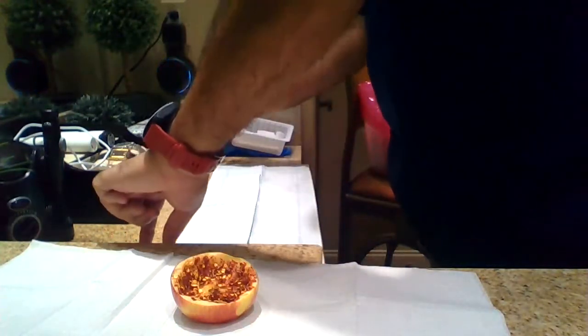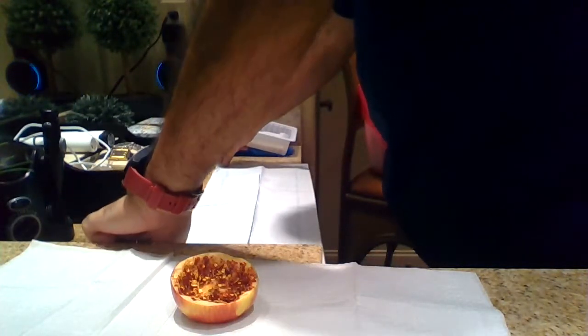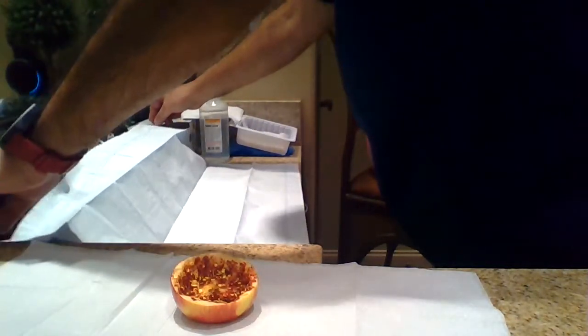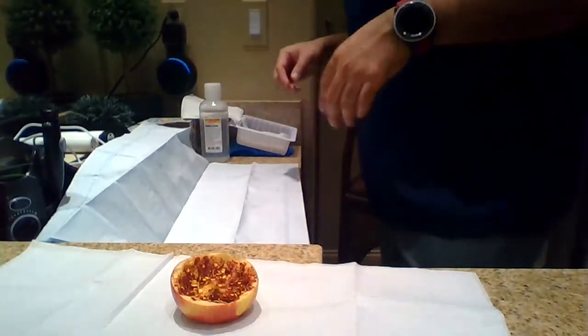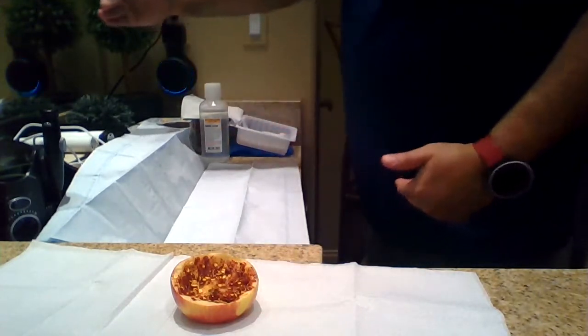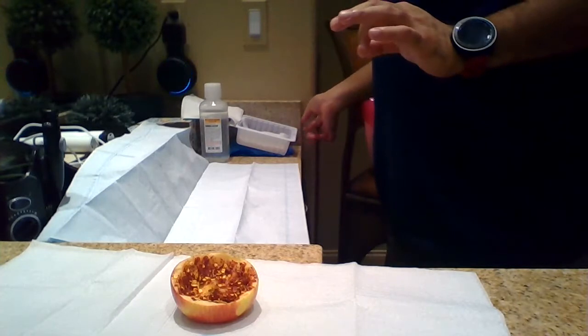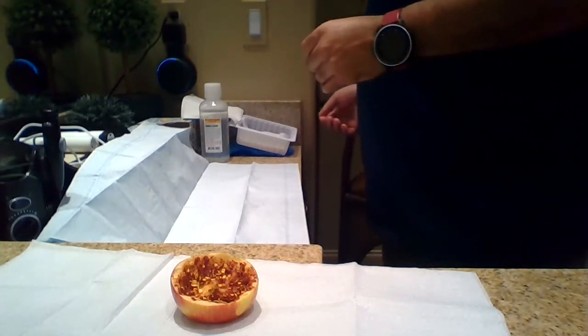And I'm very limited on space, but you know, it's a good test. Okay, we're gonna pretend it's supposed to be flat. Okay, so now we have our items there.